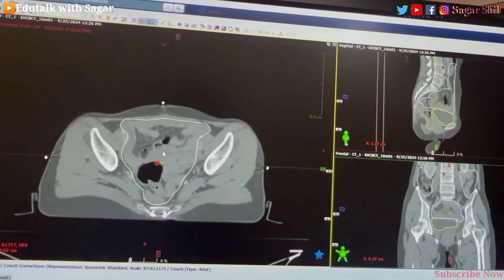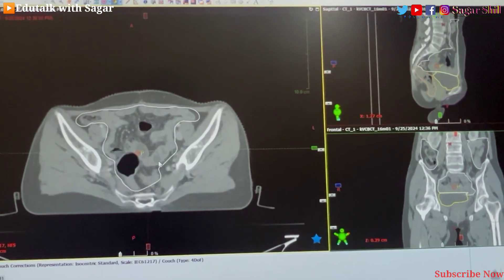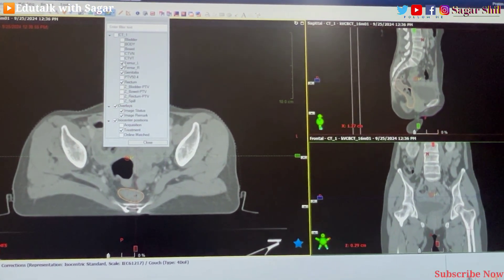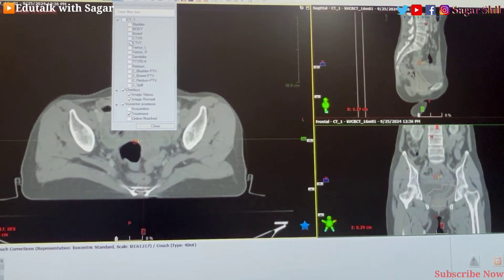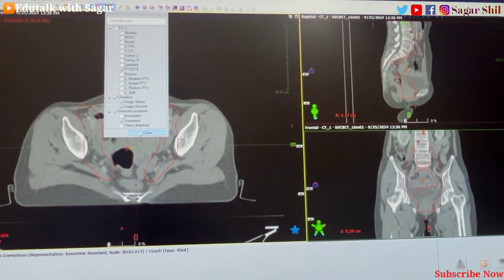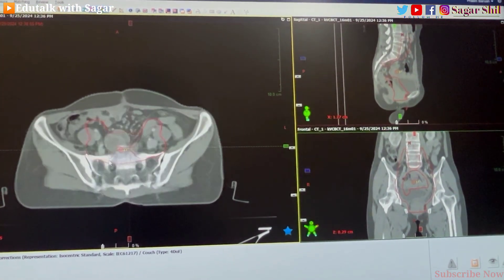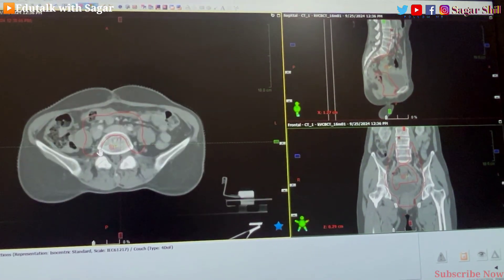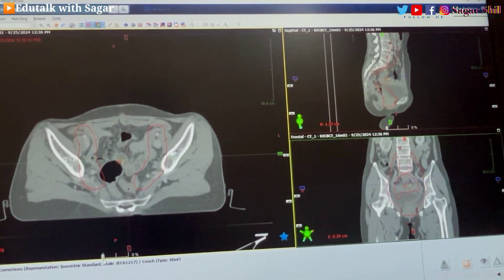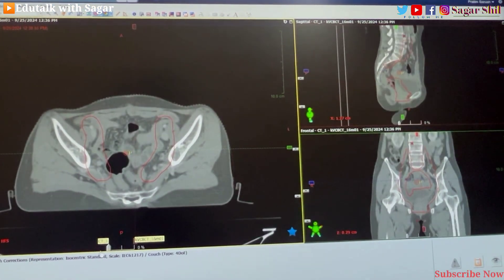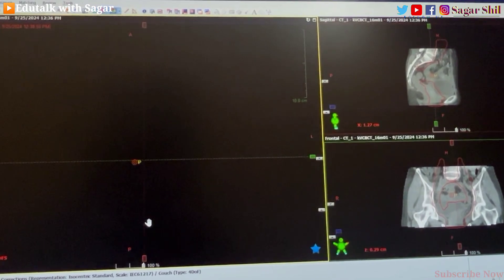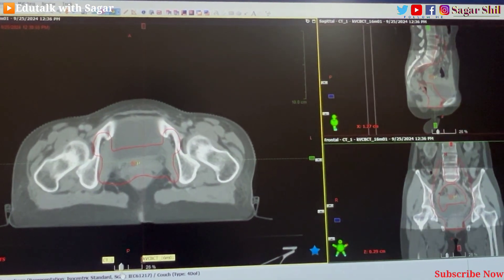All OARs you can see here. I am going to show you that during CBCT matching you should click on the PTV and CTV as well. This dose of 50.4 Gray will be delivered. Here you can see the main tumor area, and this is the CT image, and this one is the CBCT image — whatever you are seeing here, this one is CBCT and this one is CT.